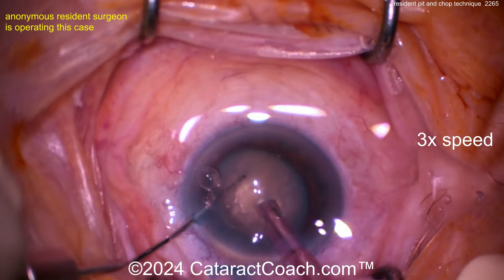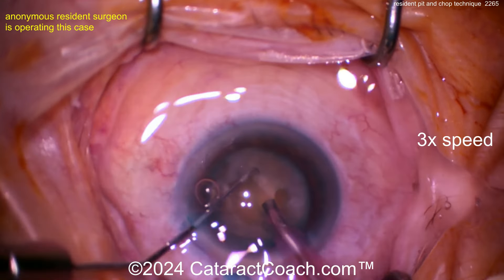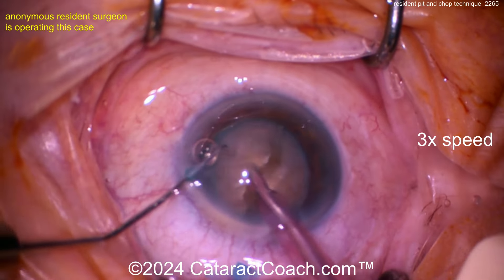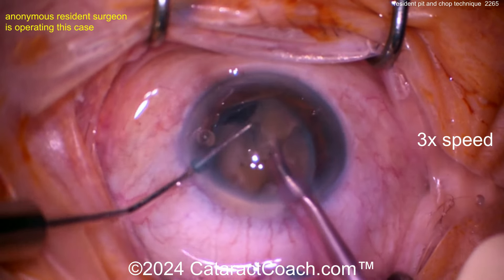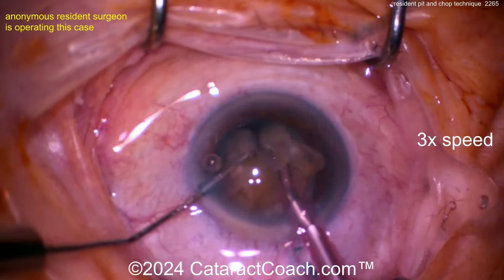Once that pit's created, go to high vacuum, embed the phaco probe, and try to get a vertical chop. Look at that nucleus — you can see a little bit of fibrotic change there, a little bit of leatheriness too. It doesn't want to separate fully. Taking your time there — nice horizontal chop now. I like this versatile chopper: vertical chop, horizontal chop, combo chop, any chop you want.